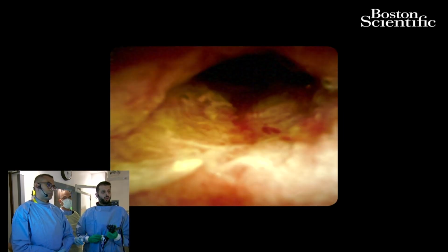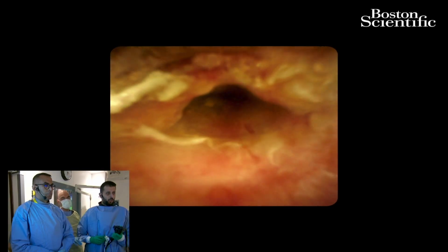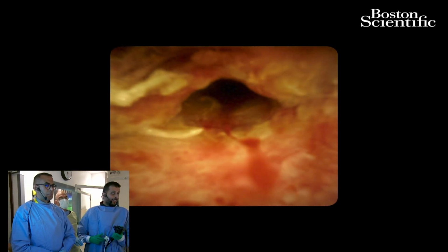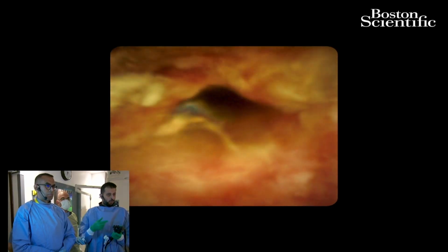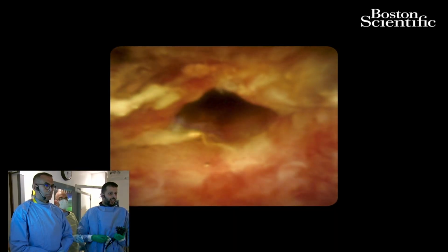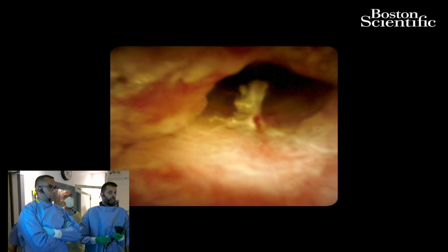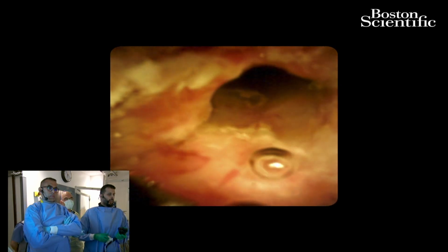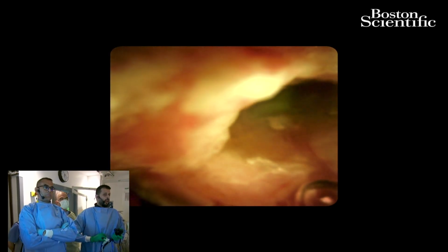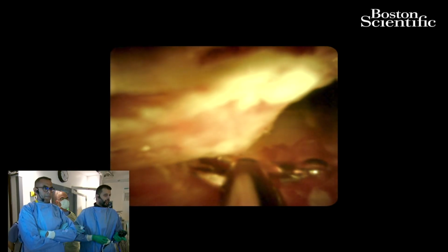Another point that I want to talk about, which Dr. Adel alluded to, is cost effectiveness data. I was lucky to publish on the cost effectiveness of SPY in the index procedure for stones, which is a different ballgame. However, it showed that for patients who come from outside of the city, who don't have access to spyglass or referrals, and come to a referral center for stones, there is a definite cost effectiveness to going ahead with SPY, assuming the patient underwent all the proper therapy, like balloon extraction, sphincteroplasty, and all that. For strictures, it is also like this. If we don't do the SPY for him, this is not going to happen for a while.